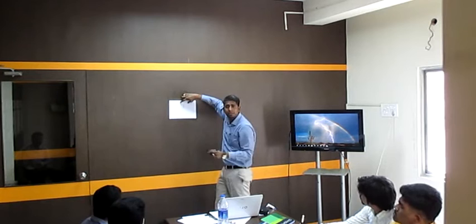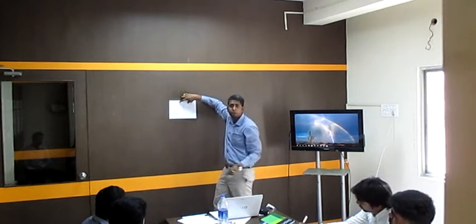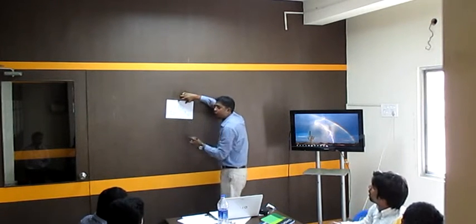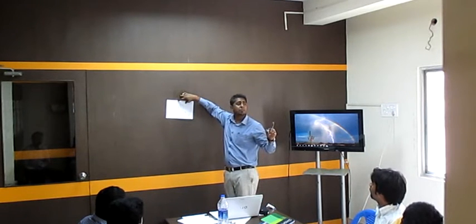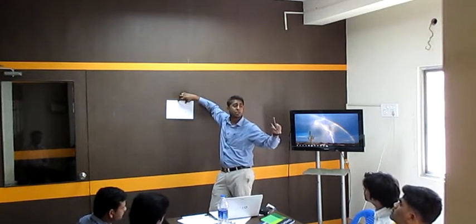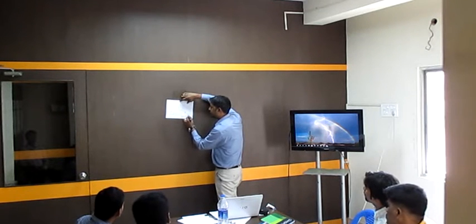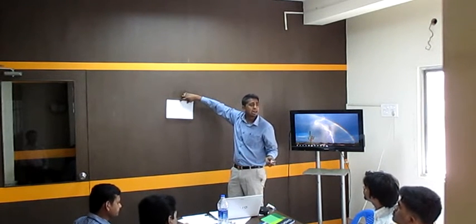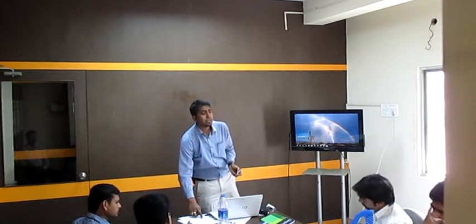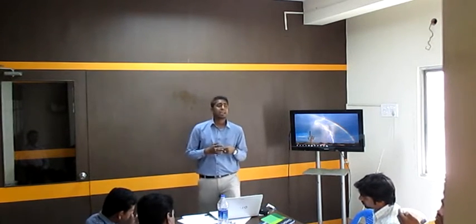In 1:1, the first number represents the input and the second one represents the output. Now input is given by whom? Input is given by micromotor. So the first number tells you the speed of your micromotor, and the second is the speed of your burr, that is the output. So in the same ratio, the speed of micromotor and speed of burr are the same. That is represented by blue color.